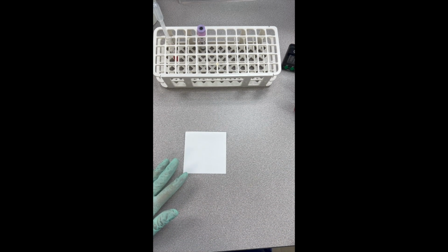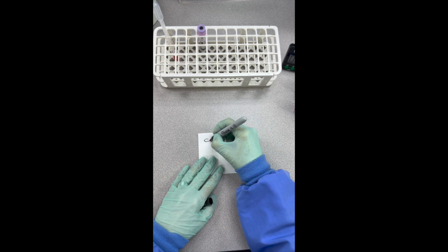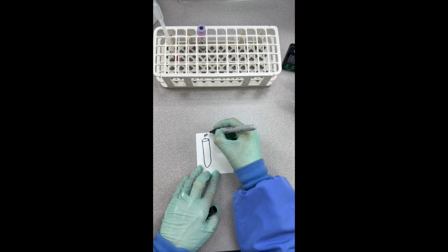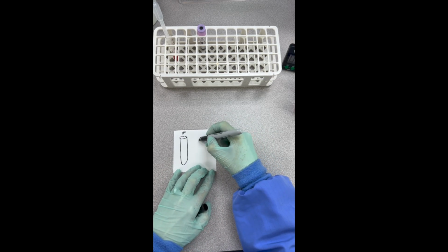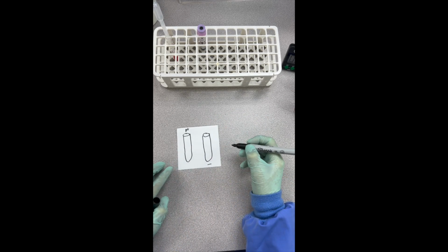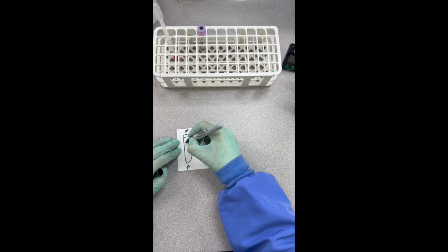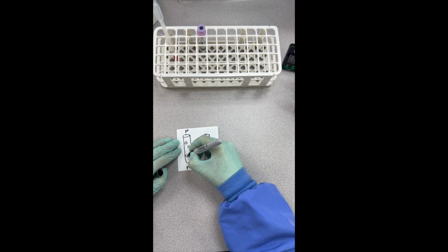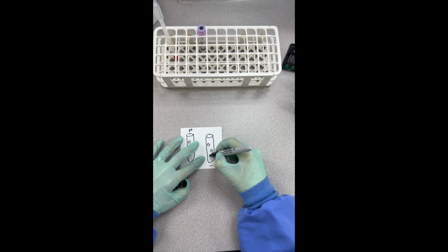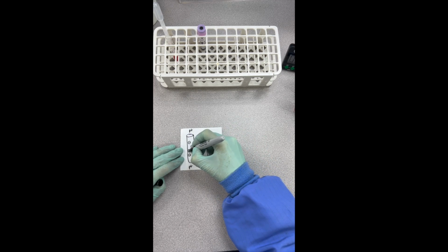Okay, so while those are in the centrifuge, let's talk about what's happening in our tubes. So I'm going to draw a picture of our tubes again. Okay, and this will be our patient. So we'll put patient up here, PT, and then right here, we're just going to look at our negative control. And there's our negative, and here's our patient. Okay, so once again, remember, this is an Rh negative mom. So we have these negative cells in here. And our negative control, again, those were all Rh negative cells. But what we're also looking for in here were those baby cells that were positive.